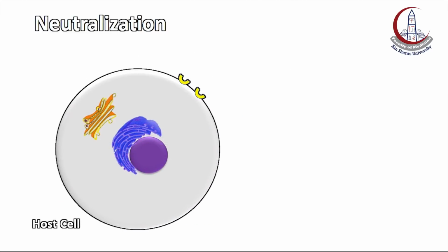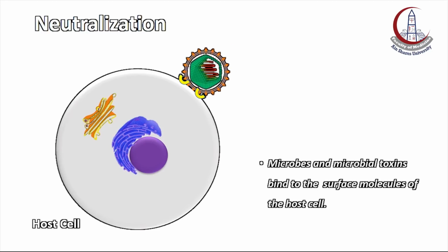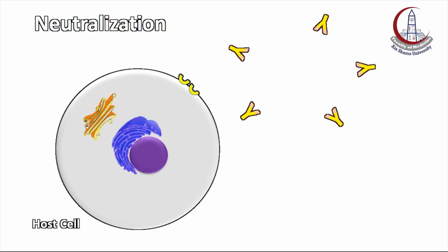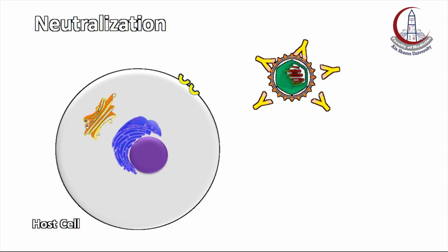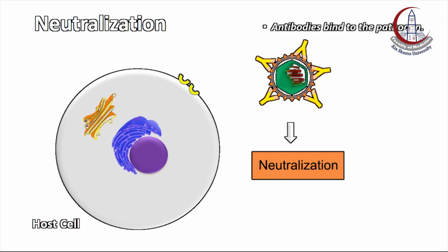The presence of antibodies against the virus can be detected by the antibody's ability to prevent cytopathic effects of the virus in cell culture. Thus, if a virus normally attaches to a cell and causes cell lysis, the presence of antibodies in the serum of the patient can be detected by the inhibition of this cell lysis in the presence of the patient's serum, which supposedly contains the antibodies.